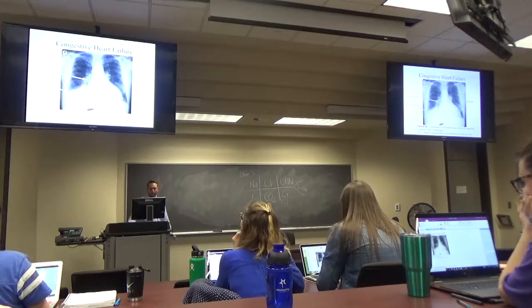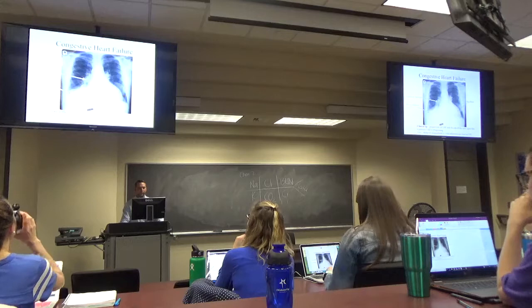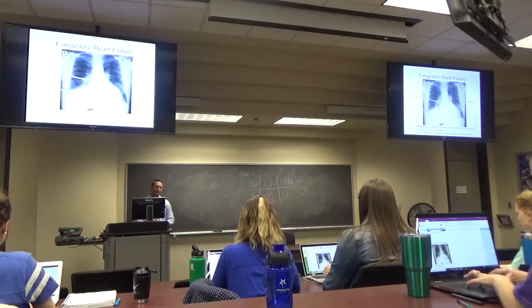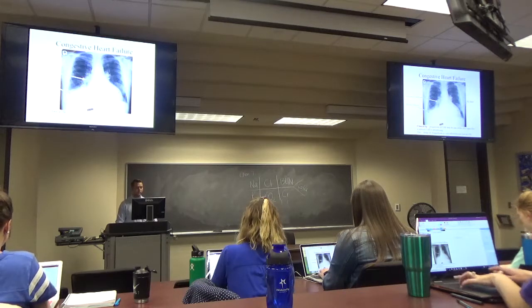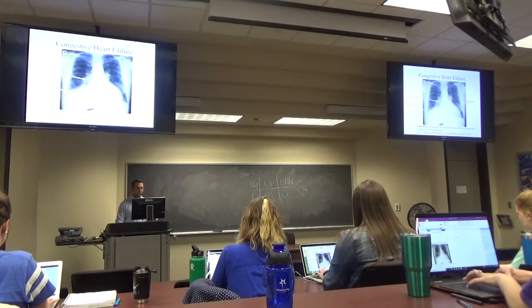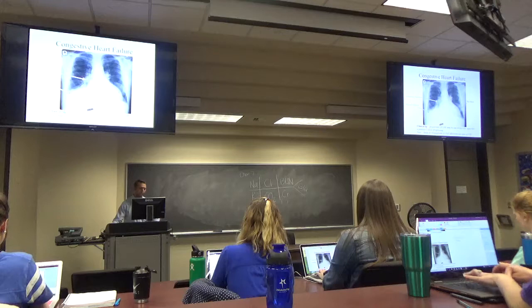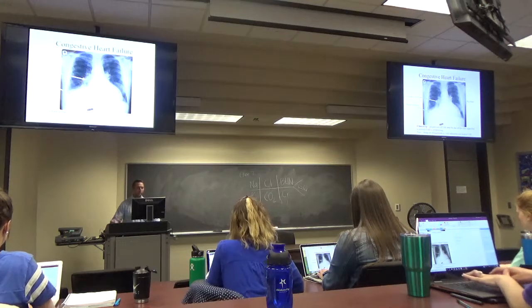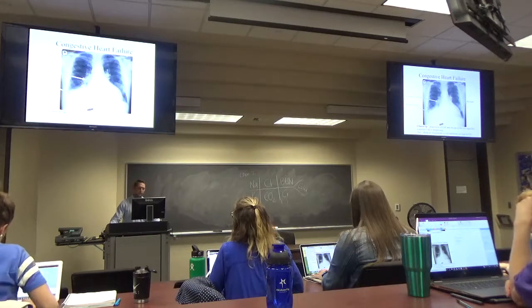So this is a clinical picture, or probably a diagram, of congestive heart failure and pulmonary edema. The three things we look for in pulmonary edema are, one, is the heart big? Two, are there pleural effusions? And three, is there perihilar edema and interstitial edema? Those are the three things we mainly look for in CHF and pulmonary edema.